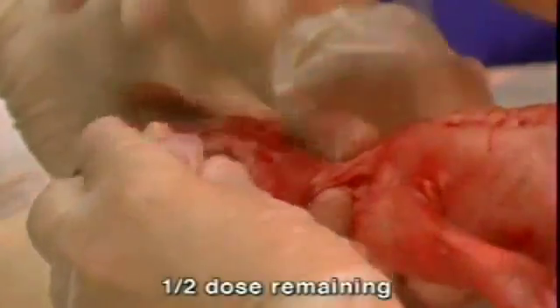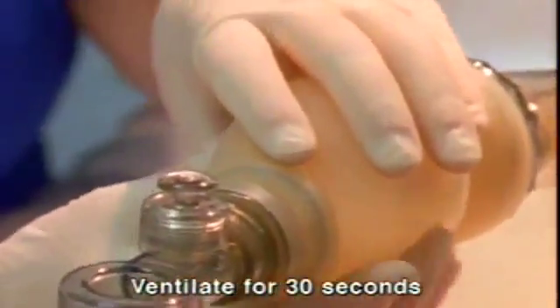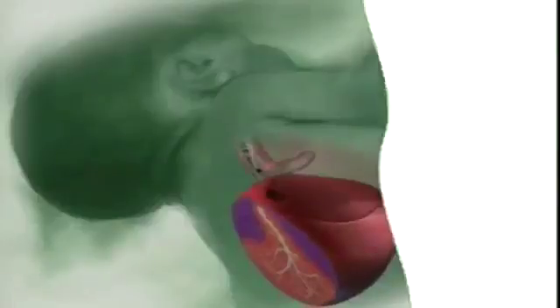Inject the second fractional dose. Again, ventilate for 30 seconds. Vary the infant's position with each of the 4 fractional doses. This allows Surfactant to reach all areas of the lungs. The sequence of positions doesn't matter as long as all 4 are used during dosing.